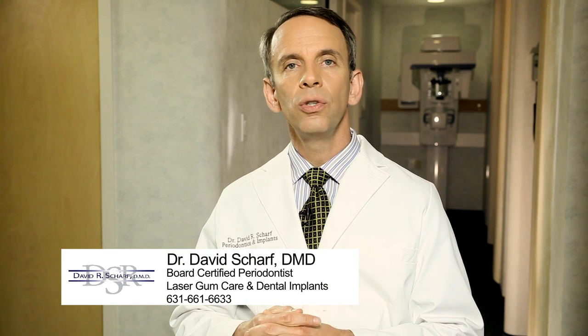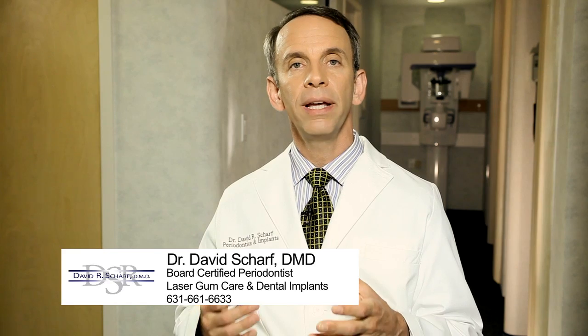Another technology solution we utilize is called the Simplant Software system. In the early 90s, when we would use CAT scans to plan dental implant surgery, the CAT scan was just read on a piece of film. It wasn't interactive. So we would hold it up to a light box, we would take our measurements so we could know how much bone was there, but there was so much information locked in that CAT scan that we couldn't access because we had to look at it on a piece of film.